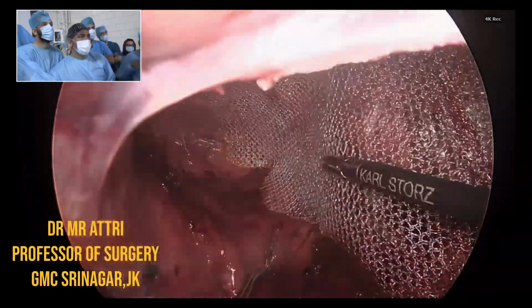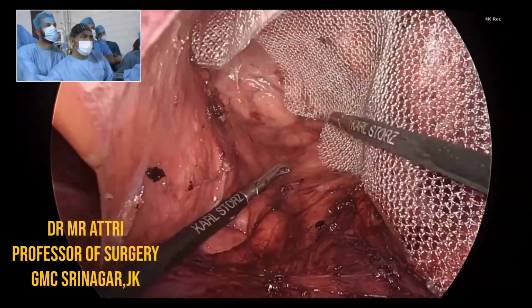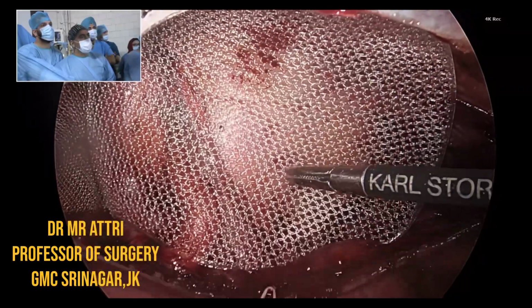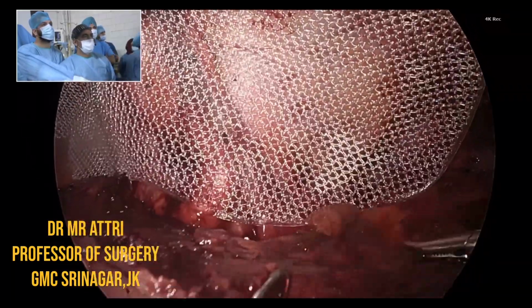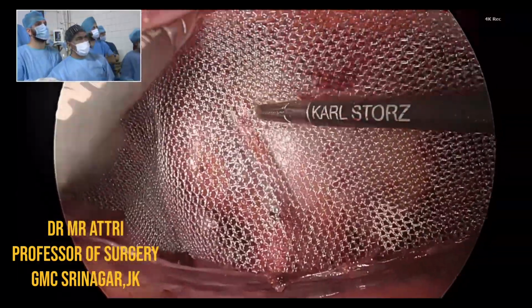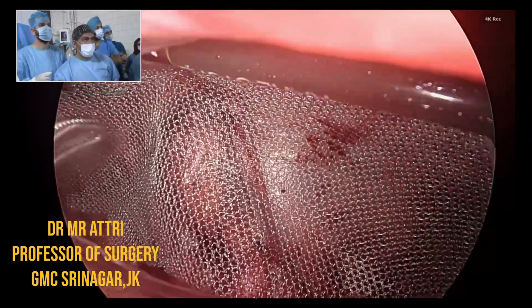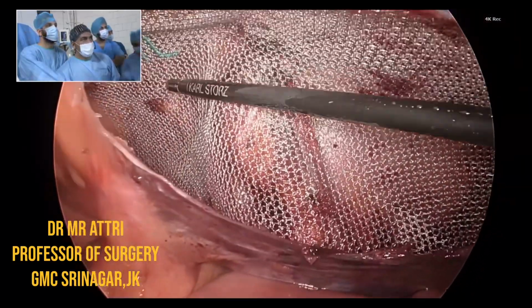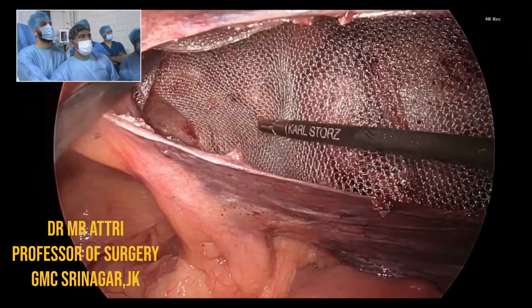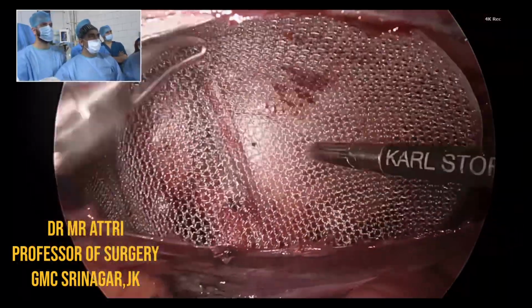So we have to see again and again that the inferior edge of the mesh has to rest comfortably over the peritoneum, and no part of the peritoneum goes behind the mesh. It has snugly got fitted. Yes, so it fits. You need to use the tackers. Yes, I am using powered tacker from Merrill. It comes in both absorbable as well as non-absorbable types. Right sir, and then I will be closing the peritoneum.